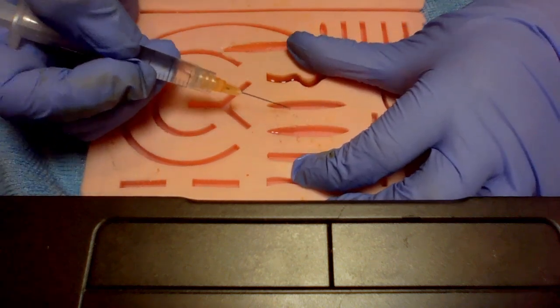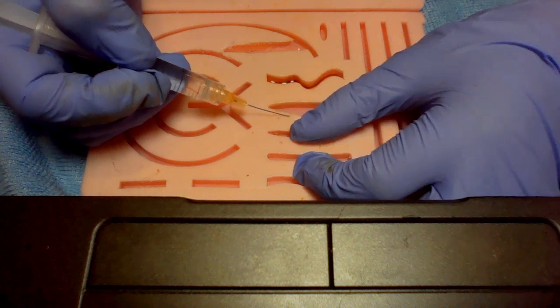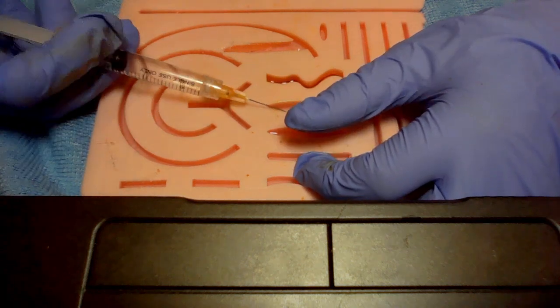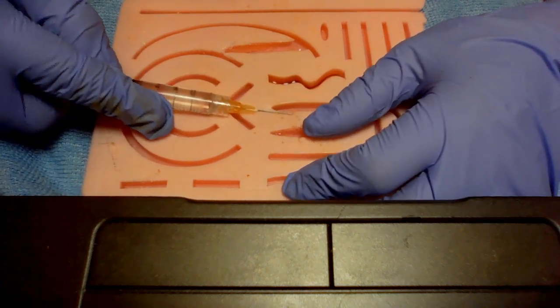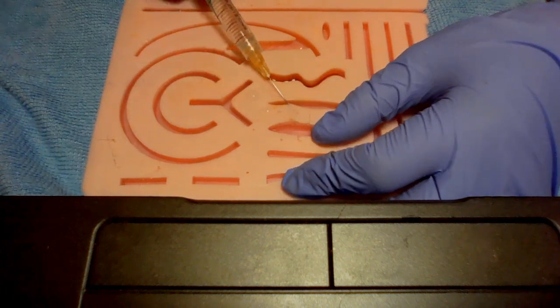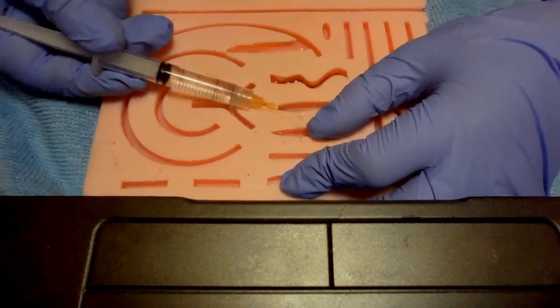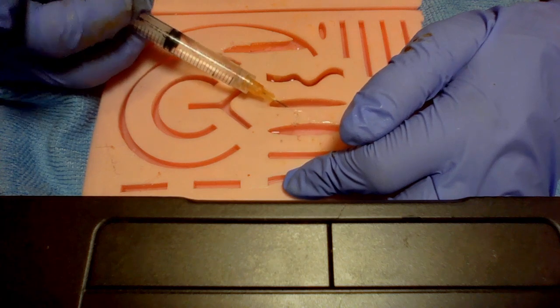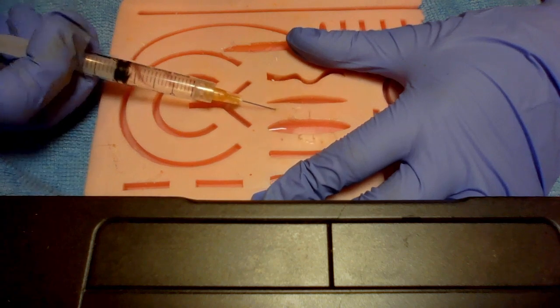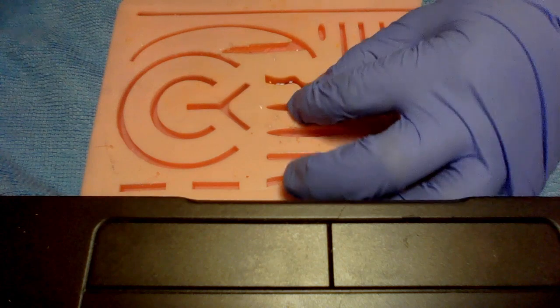So to go in the dermis, I'm going to go down, advance through the epidermis, and now I'm in the dermis. I may advance my needle a little farther, and I'm going to push. Now, if you're locally anesthetizing, you're going to want to move the needle around to make sure we get it all around in there. This model's not made for anesthetizing. Just move it around, get all the spots, because you want to make sure this person's numb.